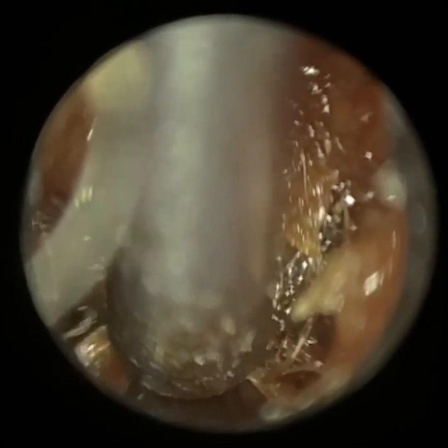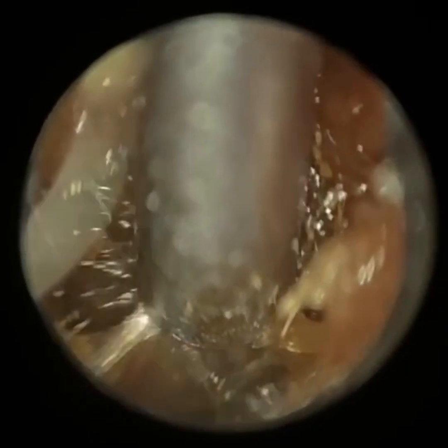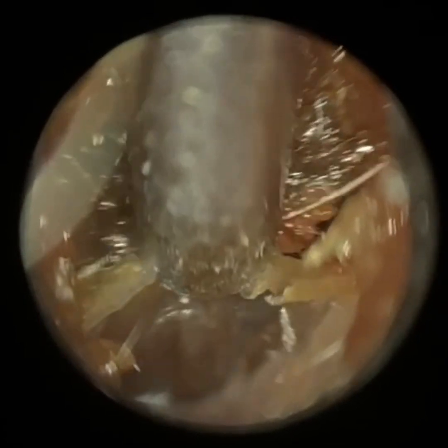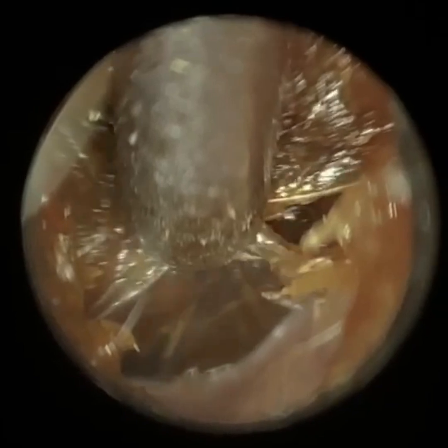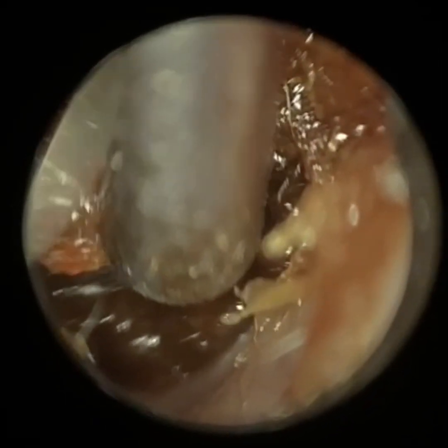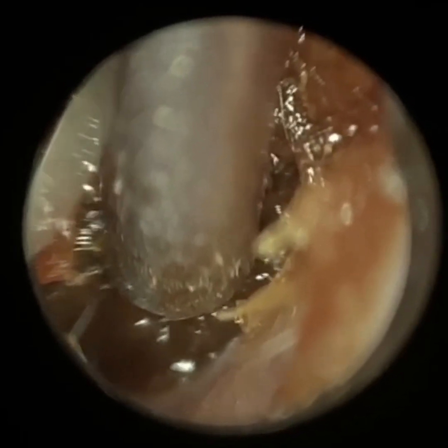The wax he's removing at the moment is just up against the eardrum. In a moment, when he lifts the skin, you'll see the annulus. The annulus is a piece of fibrocartilage which surrounds the main body of the eardrum — the pars tensa region — and it gives the eardrum its tautness. That's how we know he's working very deep. You can see the canal just below the wax he's going to remove — that's the isthmus, where the ear canal narrows and widens. It's probably half a centimetre just in front of the eardrum.